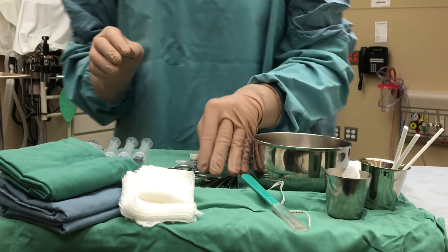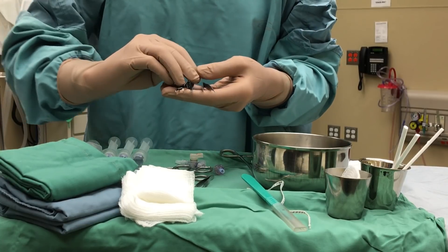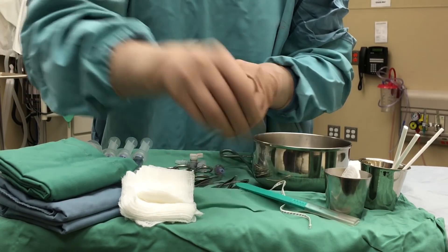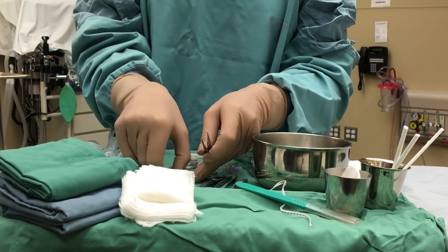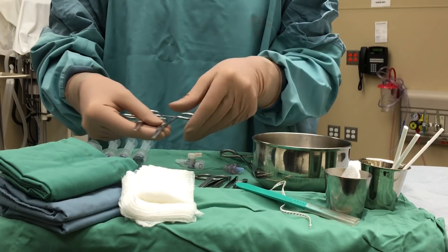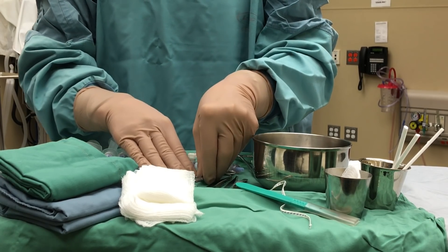We'll need various utensils. First, the iris forceps — both curved and straight — which will be useful in dilating the artery or vein for the procedure. The tooth-tipped iris forceps and the straight mosquito forceps are utilized to stabilize the cord when inserting the catheters. We also have mosquito scissors, which will be used to cut suture when necessary.